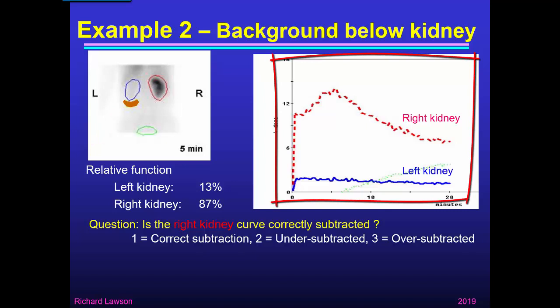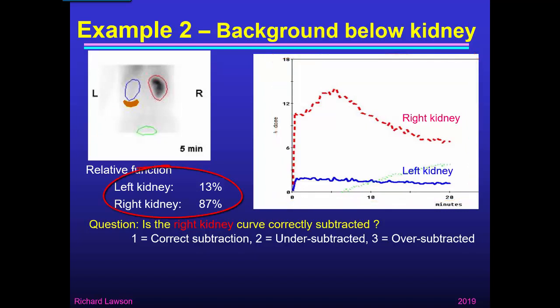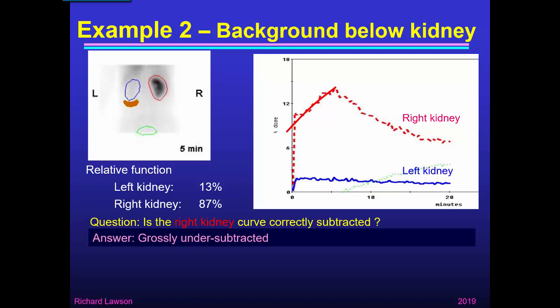I had to use some of the later images to draw the blue region around where the left kidney is. I've taken a background region underneath the left kidney, giving these renogram curves. The left kidney has only 13% of the patient's total renal function. Looking at the red curve for the right kidney — I think this is grossly undersubtracted. There is a very rapid rise representing a vascular phase. If we take the smooth part of the curve and extrapolate it, it gives a positive intercept on the axis, meaning the curve doesn't start from zero.